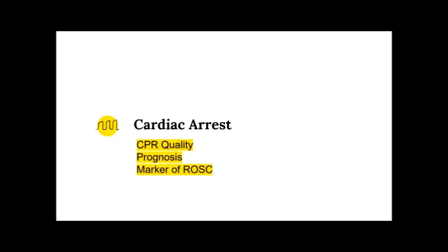Okay, so we started off by talking about the section where the evidence doesn't support its use. What about the other side, cardiac arrest? Can I just get a hands up to see who's routinely using end-tidal CO2 in their cardiac arrest patients? So a huge number. Great. We're going to focus on 3 areas of cardiac arrest. We're going to talk about CPR quality, prognostication, and using end-tidal as a marker of ROSC itself.